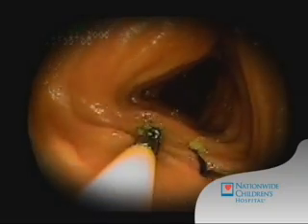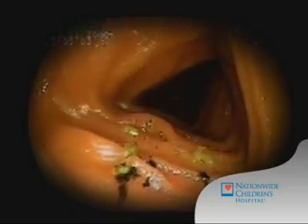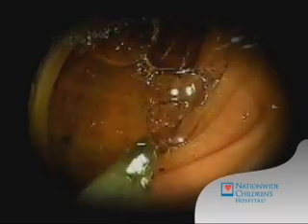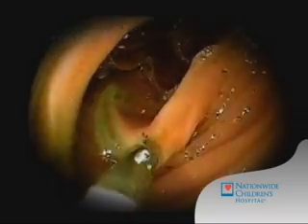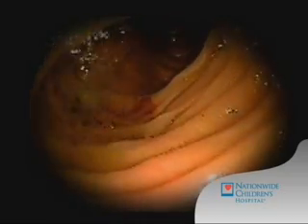In addition to diagnostic looking, we're also able to perform a variety of other procedures, including biopsy. A biopsy forcep is used to take a sample of the lining of the small intestine.